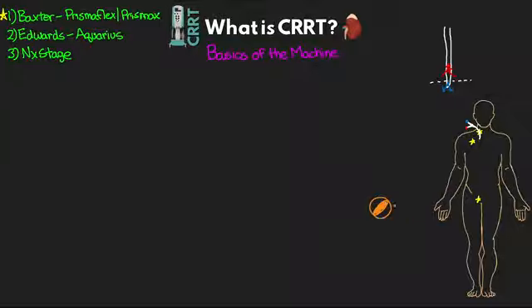And so this pump here is a roller pump, and this is going to create negative pressure on the patient side to draw blood from the patient, and then positive pressure on the machine side to drive that blood through the filter and then return it to the patient.